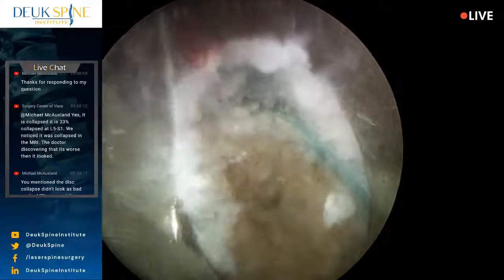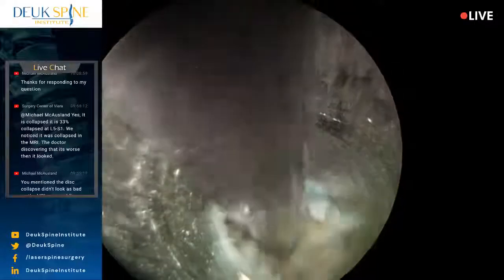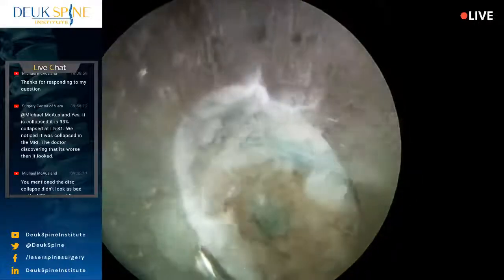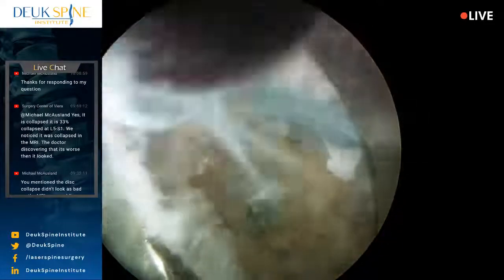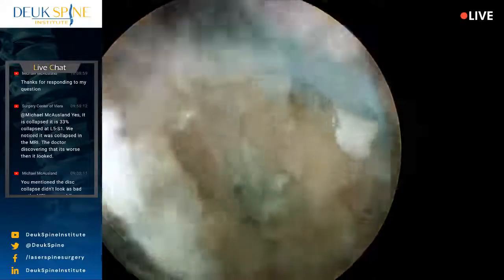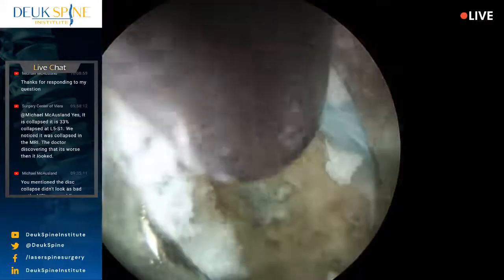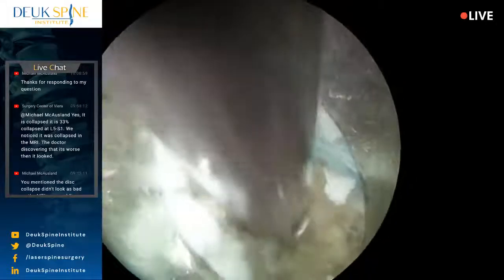Now, when we do this surgery or any surgery on the spine, you can't expect the disc to look normal, okay? The disc is never going to look normal again once you've damaged it. Discs don't ever go back to looking normal. So if the expectation is to see a normal looking disc, this is not plastic surgery of the disc. This is not a boob job of the disc where at the end you expect perfect breasts, all right? This is not a cosmetic procedure. We are not doing cosmetic surgery here.